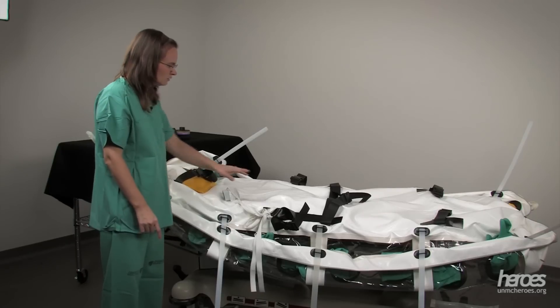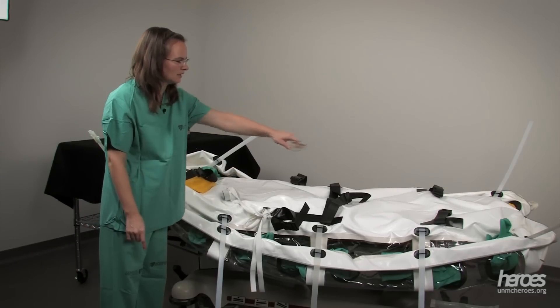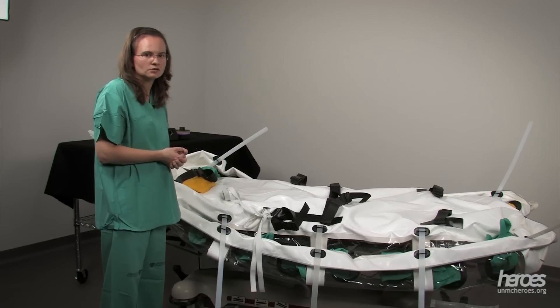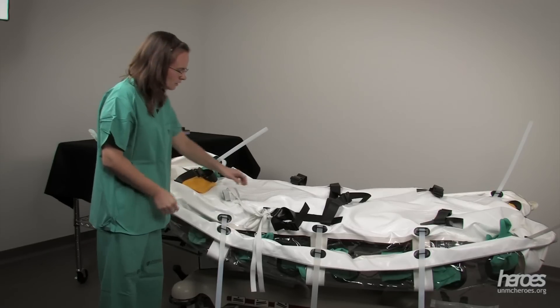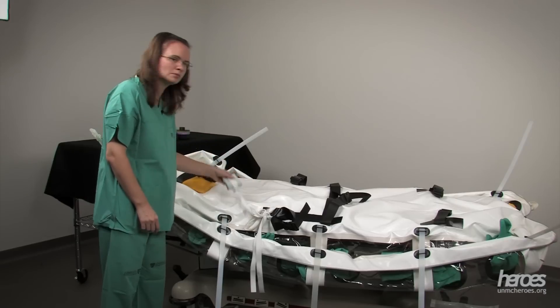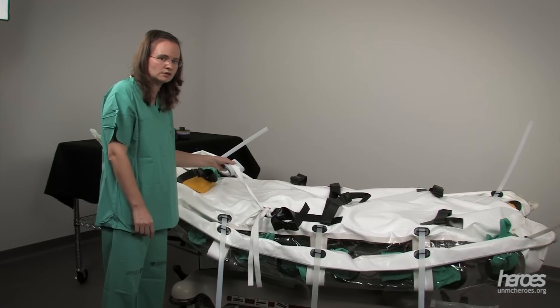The straps are at the head, wrist, waist, and legs. These straps are restraints and we would need a doctor's order to use them. The straps are held on by fused connectors, and you could connect a more typical restraint to those connectors if you wanted to.